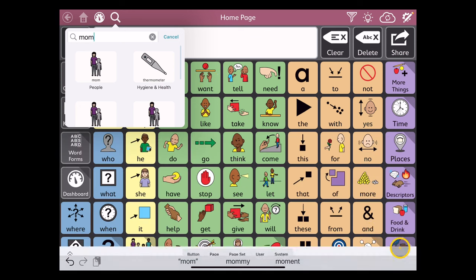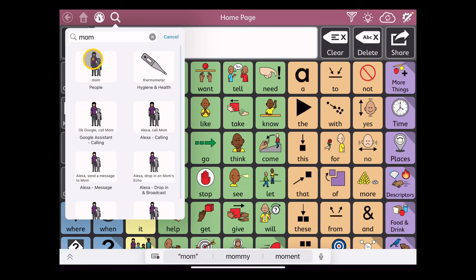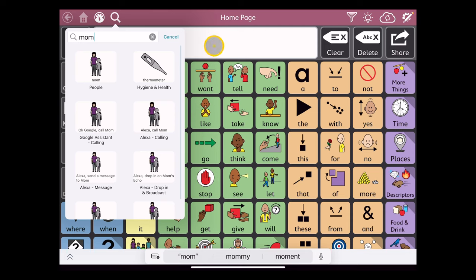The difference between this and TDSnap Core First is that all of the buttons in the motor plan sets send to the message window and speak, so you'll see fewer options for a word like 'mom' because the buttons in this system are meant to do both speaking and writing functions.